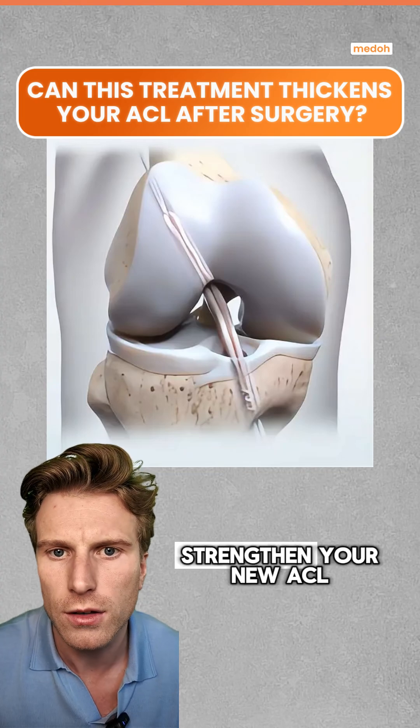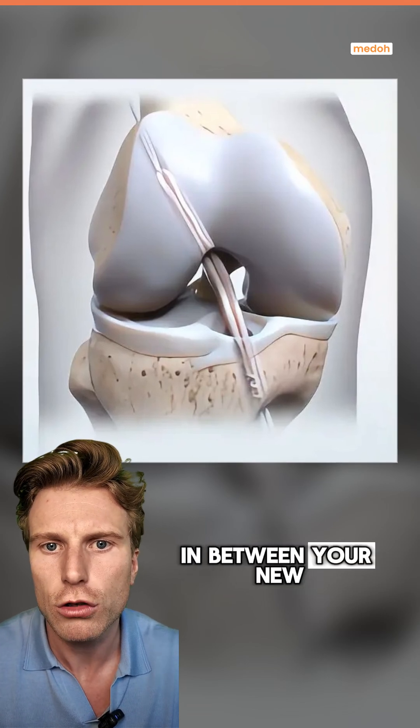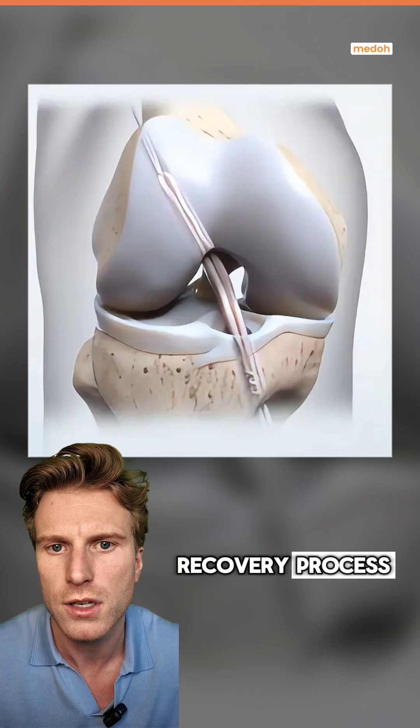Here's a new treatment doctors are using to strengthen your new ACL after surgery. It's called the Biobrace, and it's a small implant that's placed in between your new ACL during your ACL reconstruction. Its job is to thicken your ACL but also protect it while you're in the recovery process.